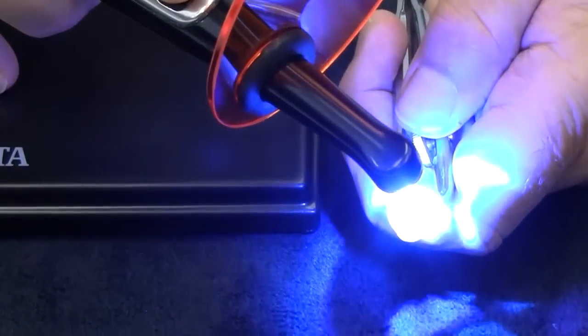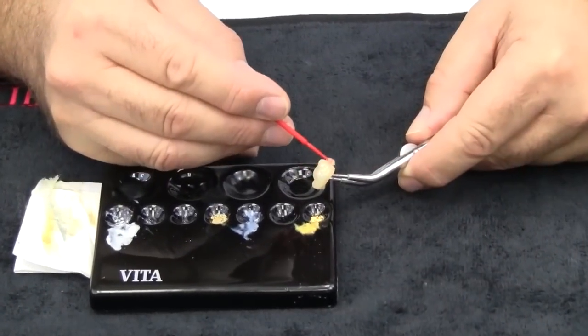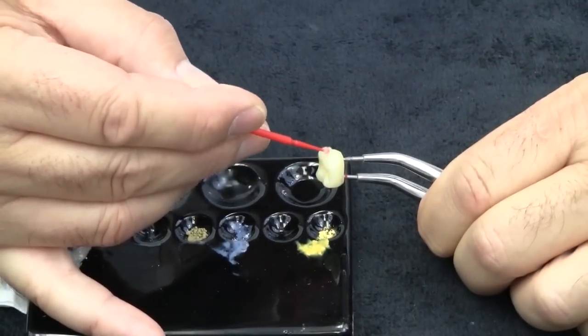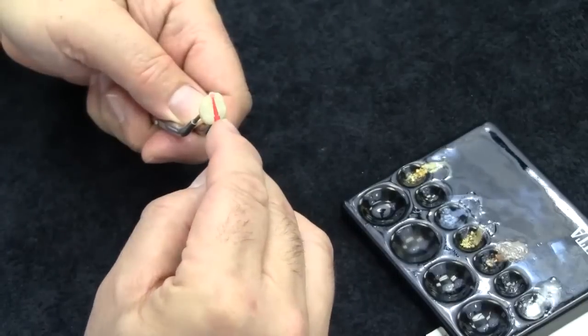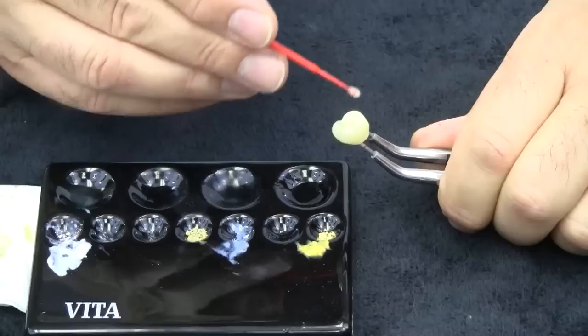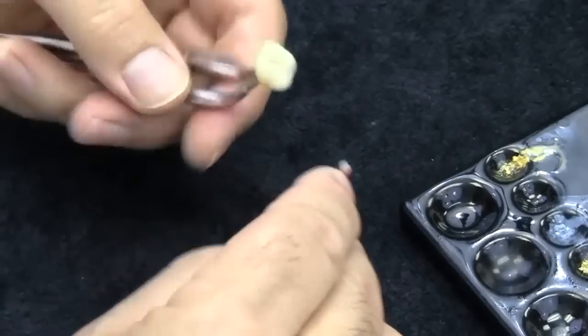We are ready to light cure and fixate the stains prior to glazing. Cure for five to six seconds as shown. Dispense a few drops of the glaze liquid onto the large palette well and apply glaze using a clean disposable micro brush. Apply the glaze in an even sweeping action from the mesial to distal as shown. Continue to the palatal surfaces and if necessary apply minimally to contact areas. Apply the glaze to the fissure with caution to prevent running or puddling, then cover the cusp tips with a light sweeping application.